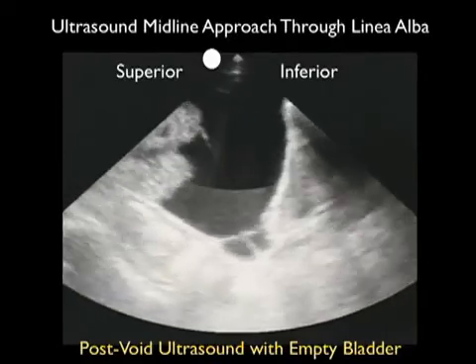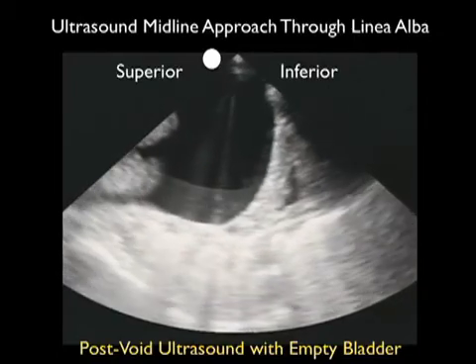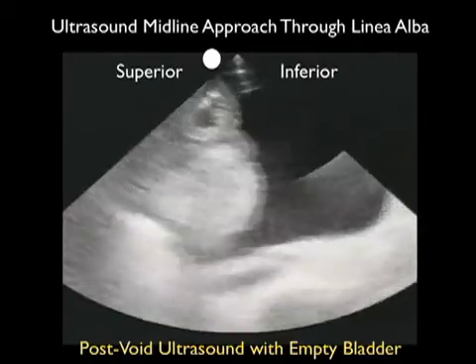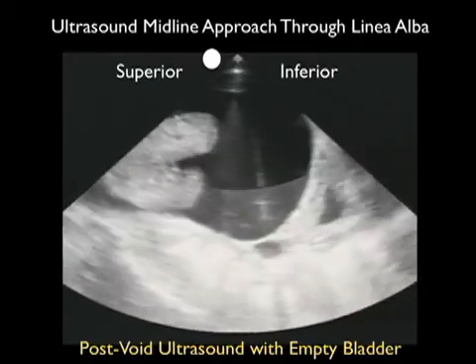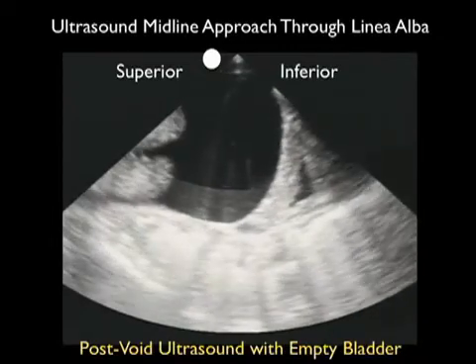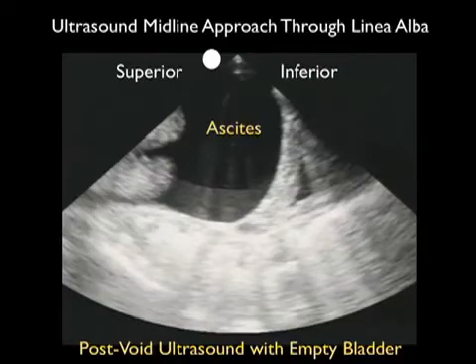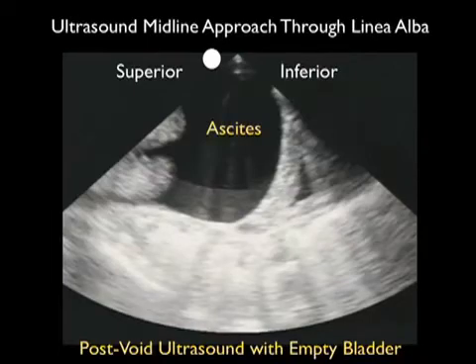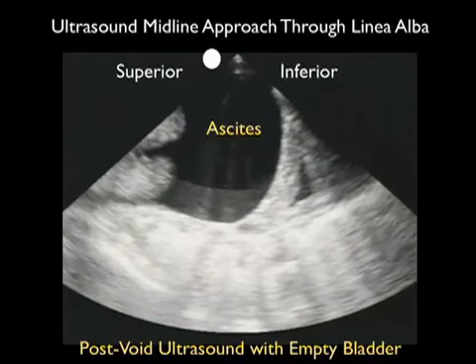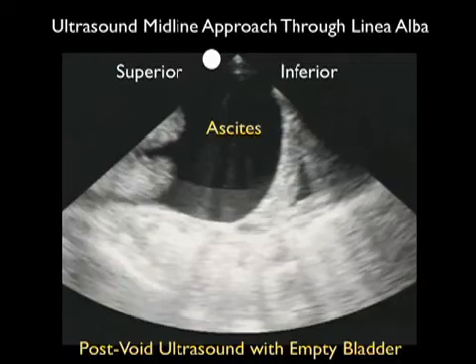Here is a video clip taken from the same patient after having him completely void. Now we have the decompressed bladder, making the ascites pocket much larger and more amenable to a paracentesis puncture from the midline linea alba technique. We can see the pocket of ascites as denoted by the darker anechoic fluid collection between the bowel superiorly and the decompressed bladder inferiorly.